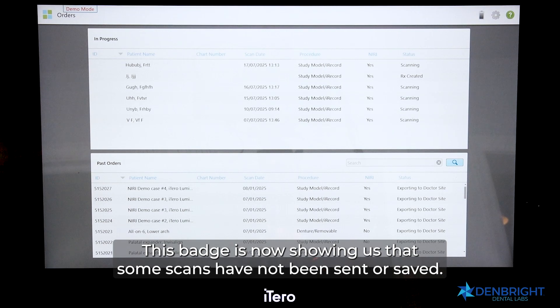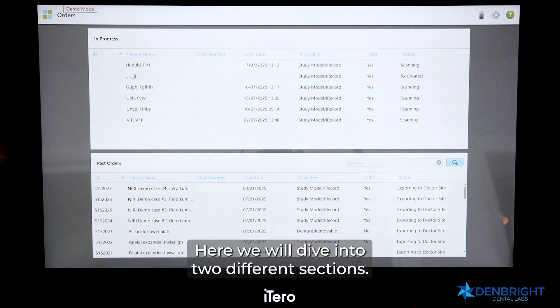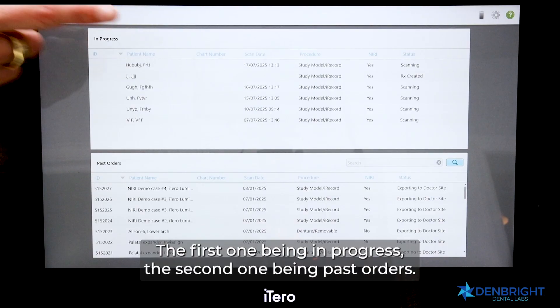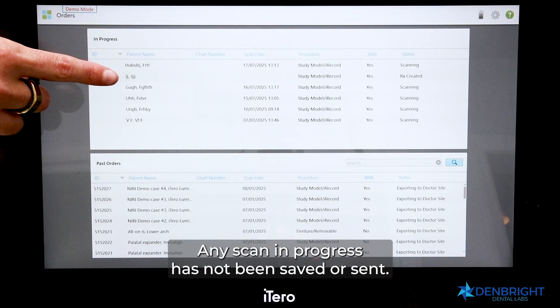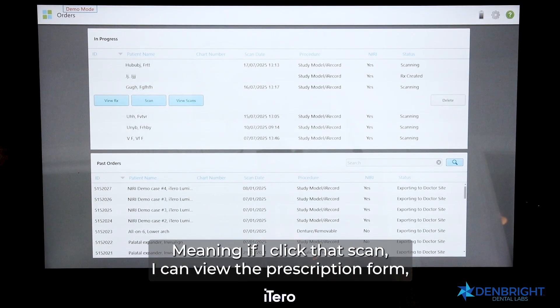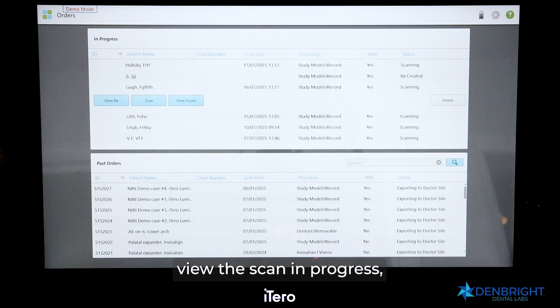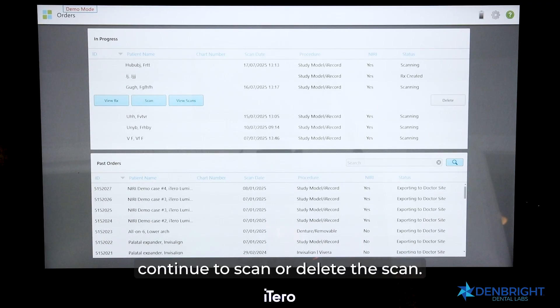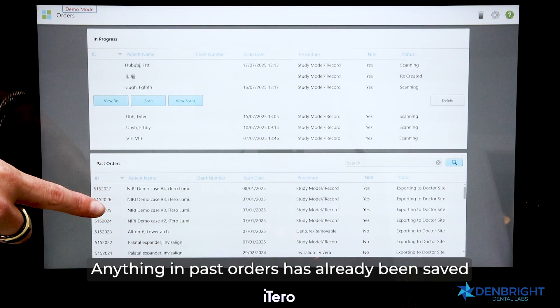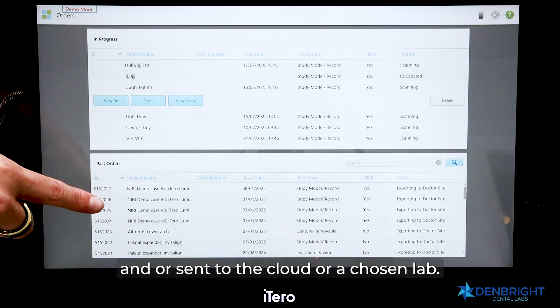Our third square is the Orders tab. Here we can see a badge showing that some scans have not been sent or saved. There are two sections: In Progress and Past Orders. Any scan in progress has not been saved or sent — clicking it allows you to view the prescription form, view the scan, continue scanning, or delete it. Anything in Past Orders has already been saved and/or sent to the cloud or a chosen lab.